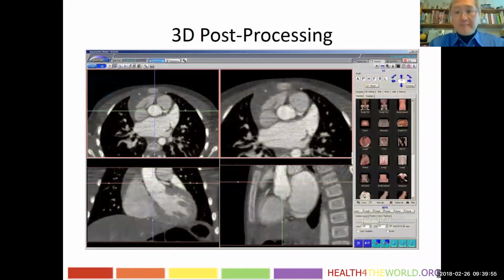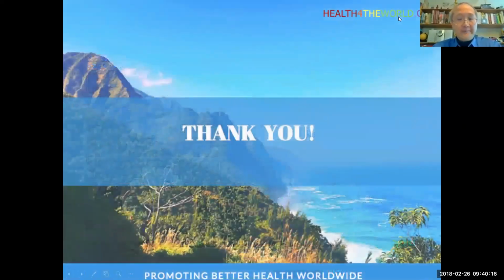And finally, almost everything that we do on CT volumetric acquisition as well as MR volumetric acquisition needs competent 3D post-processing workstations. Quite often we have to reorient our slices to highlight the mass the best we can. So 3D post-processing is absolutely crucial. Okay, thank you.